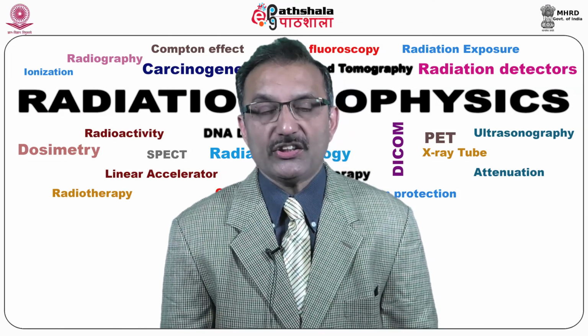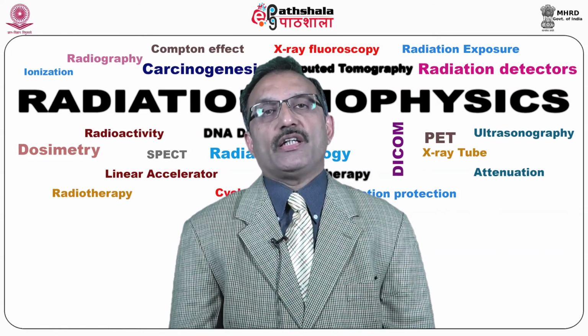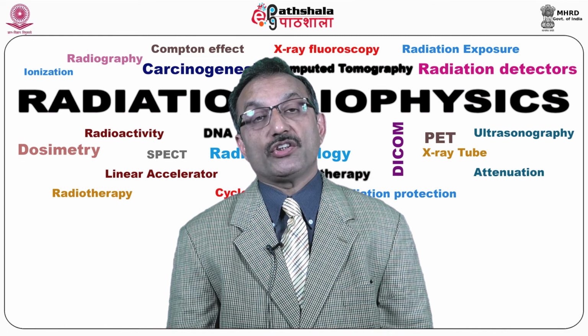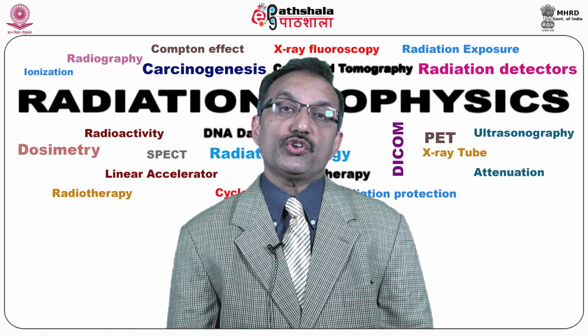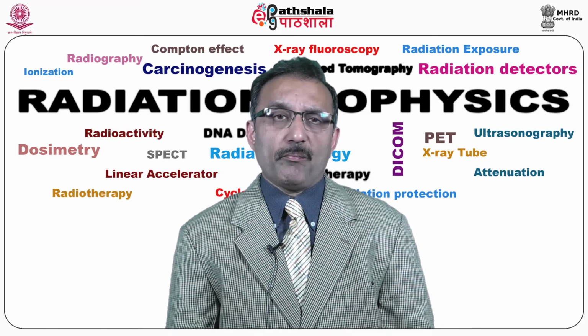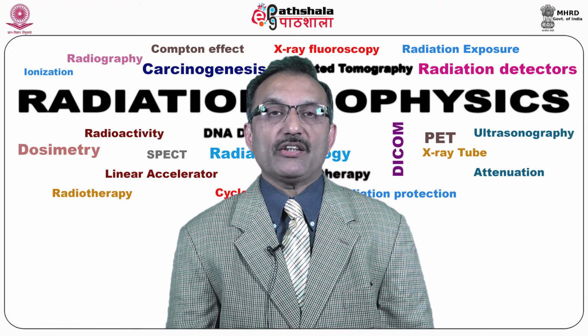Because what usually happens is that instead of X quantity, you give Y quantity, you are doubling the dose because you want to finish sooner. What is exactly happening in such cases is that you are giving more dose to the patient. The quality of the images is there, but you are unnecessarily giving dose to the patient to get the images.